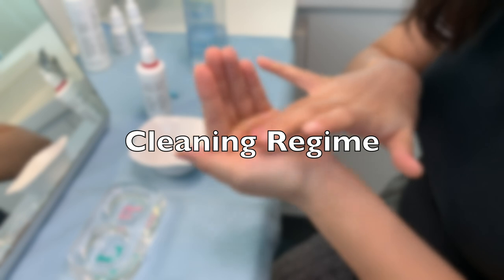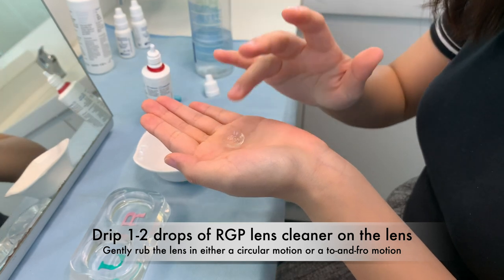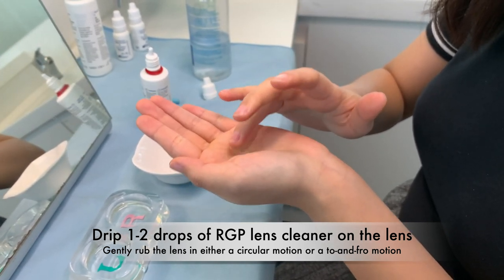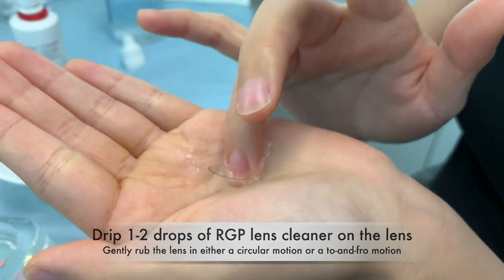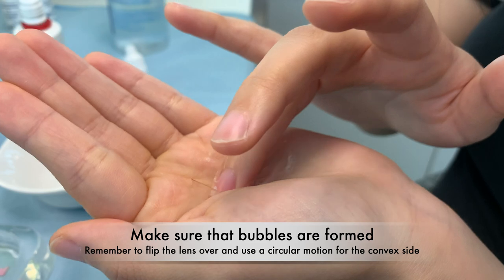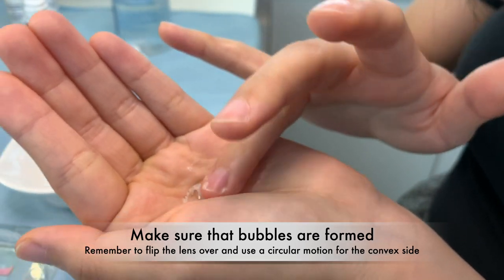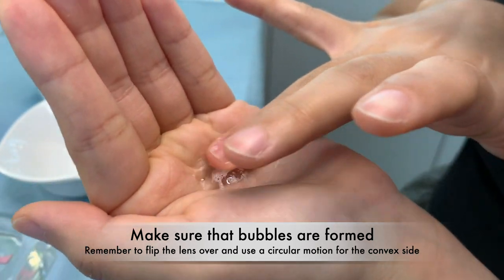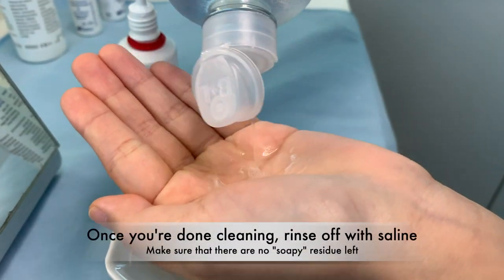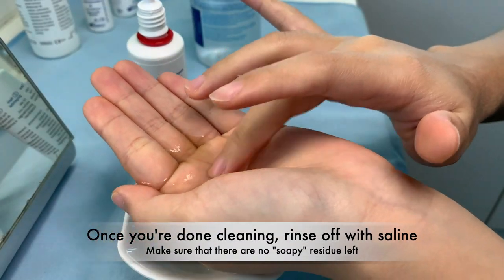Next, I will show you how to clean the lens. Drip 1–2 drops of RGP lens cleaner onto the lens and gently rub in either a circular motion or a to-and-fro motion. Make sure that bubbles are formed. Also remember to flip the lens over and use a circular motion for the convex side. Once you are done cleaning, rinse off with saline and make sure there is no soapy residue left.